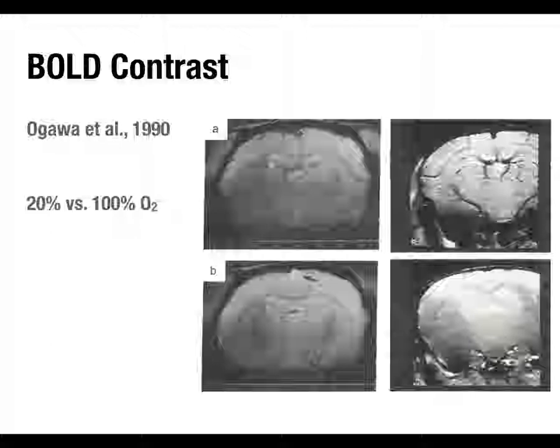That's a bit of a fudge, but what you're seeing is that the black lines are because you've got deoxyhemoglobin, and that's causing disruption of the magnetic fields. So where all the pulse sequence parameters are set, assuming a particular magnetic field strength because of the strength of the scanner itself and the magnetic field gradients, the deoxyhemoglobin is actually changing that magnetic field quite locally in the vessels. And so the signal drops off faster there than it does in the other parts.